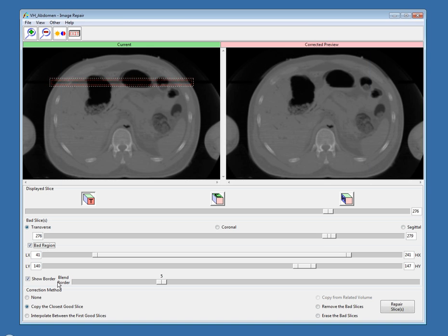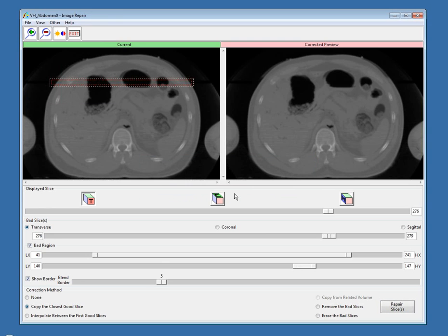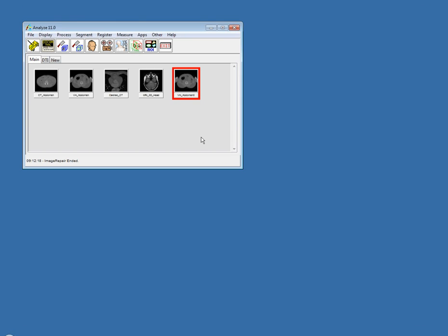With the bad region option, the corrected voxels will be blended out into the surrounding data within a blend border. I'll go ahead and choose to repair slices now and make a copy. You can already see the corrected preview and the dramatic difference. This is a basic module, but it can be very powerful and very useful. I'll exit and you can see my corrected data set now in the workspace.